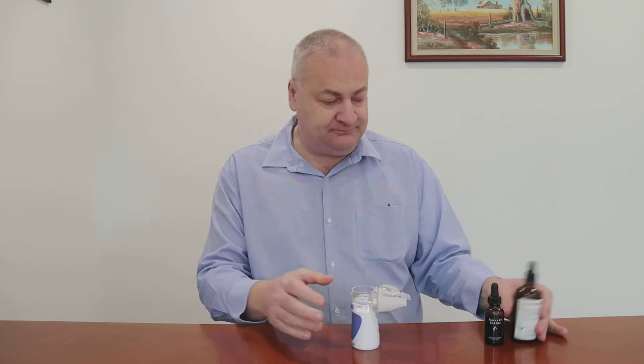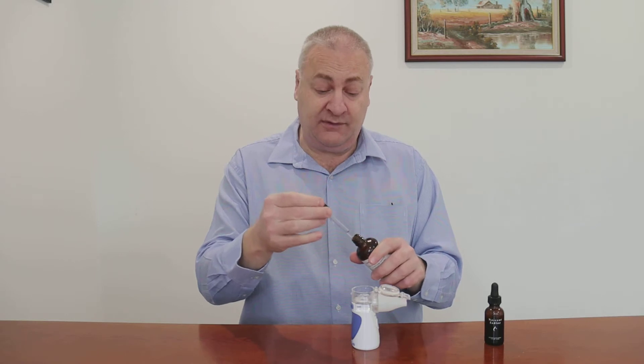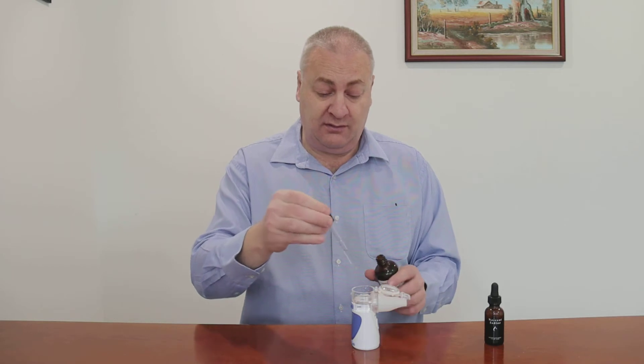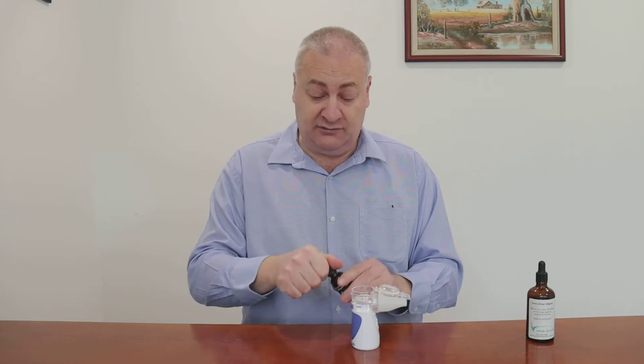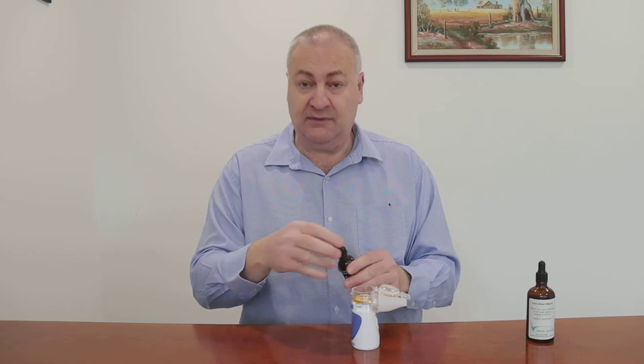So we open the cap and going to put in two mils of Ionic Silver — that's one mil, two mils — and I'm going to add two drops of iodine to it. Two drops, that's it.